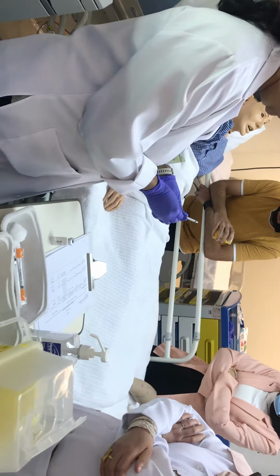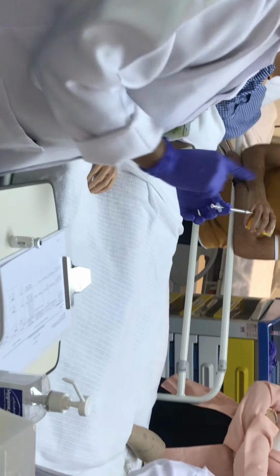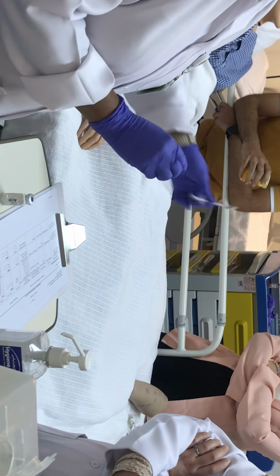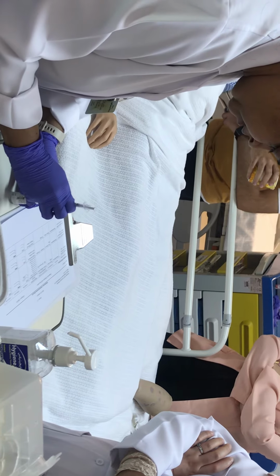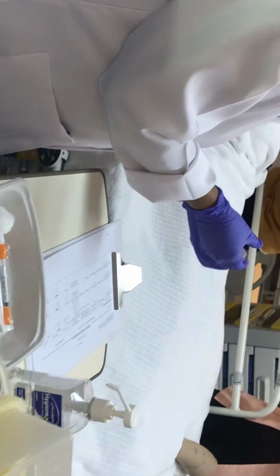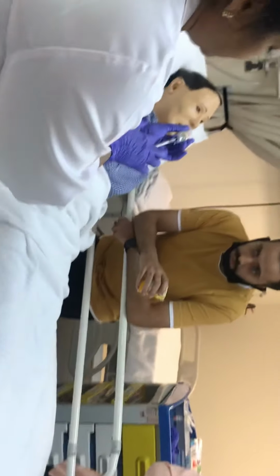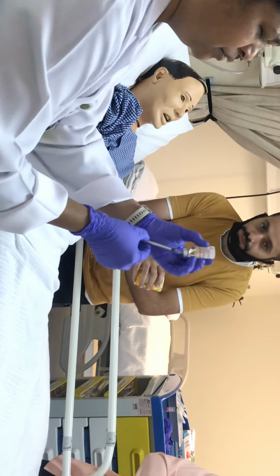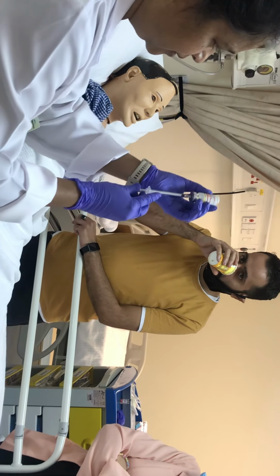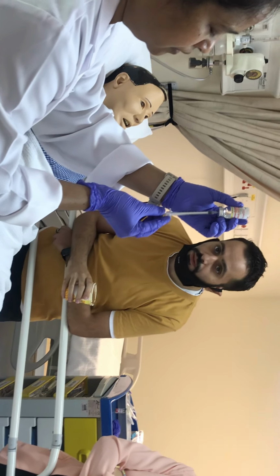Then always, when you want to withdraw from the vial, you should take air equal to the amount you want to withdraw. So it is just 10 units. Okay, push it inside. When you are pushing it inside, keep it in this direction. Then when you want to take it, ideally they should hold like this, let it be supported in the arm. But if they don't know, they want to do it in a different way, no problem. Better to keep it at the eye level. Okay, medicine started coming on.